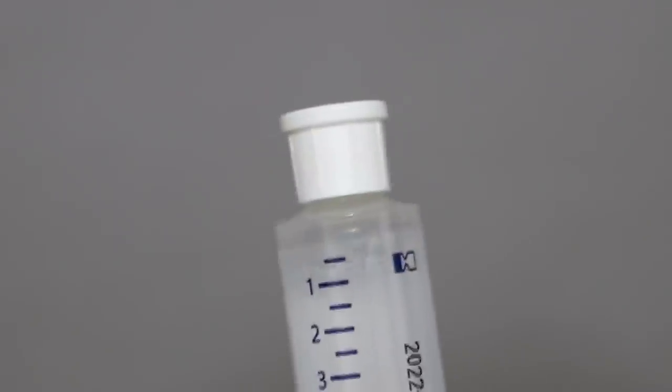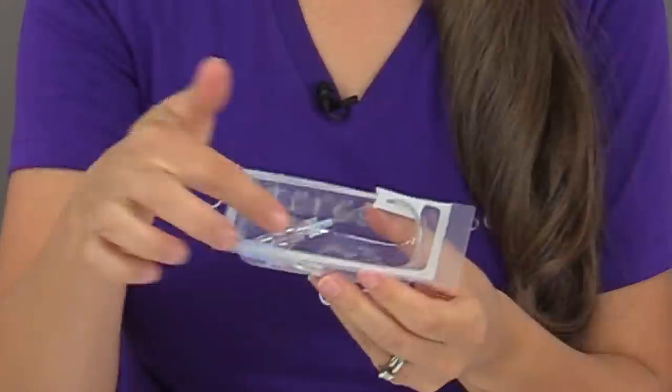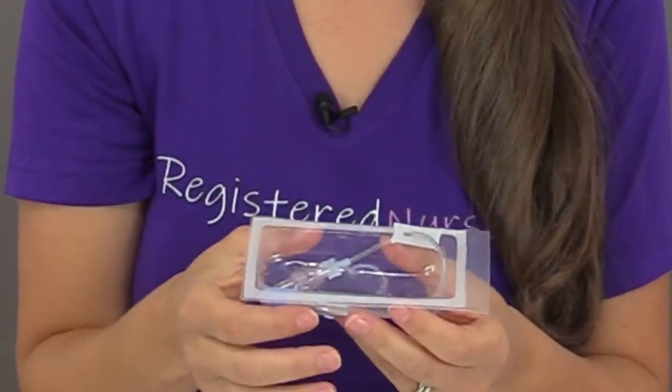So why do we go through this priming process whenever we are starting an IV? Well, the saline flush is pre-filled with saline and it has an air bubble inside of the syringe that we must remove because we don't want to inject that in the patient. Also, our extension set — inside this tubing there's nothing but air, so we want to make sure that we fill it with saline.